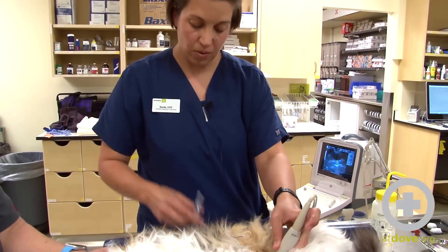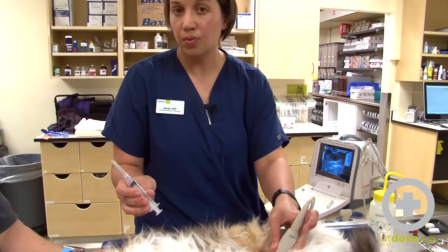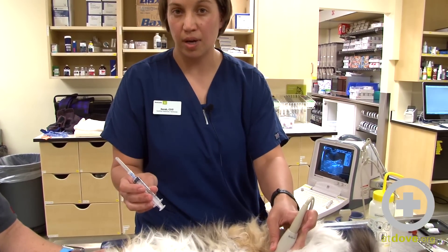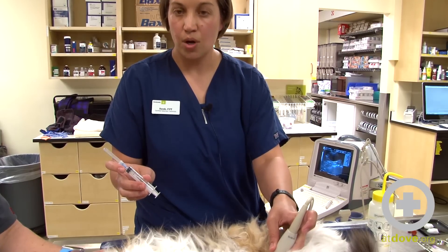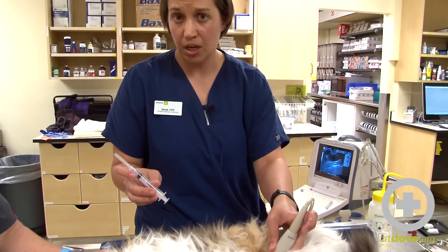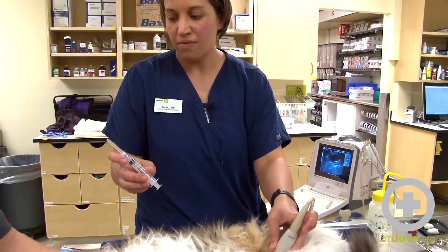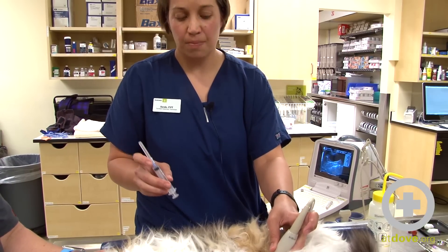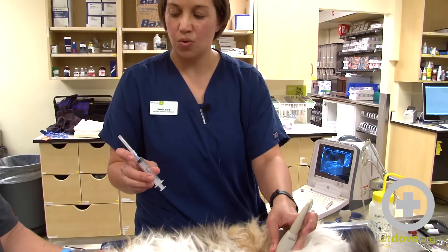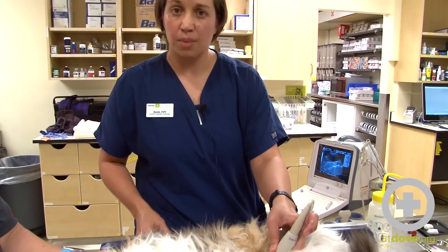Today I'm going to be using a 6 ml syringe. Frequently we will use between a 3 and a 12 ml syringe depending on the sample size we need, and a 22 one-and-a-half inch needle. The needle length is more for the flexibility of the needle than the actual length of it — we just don't want too stiff of a needle causing trauma to the bladder.